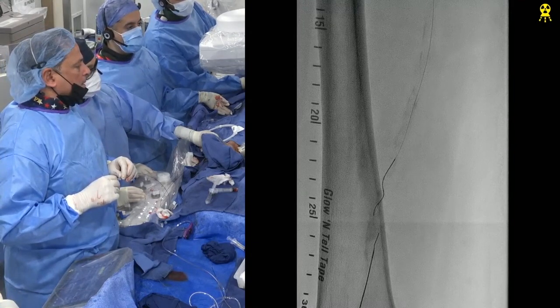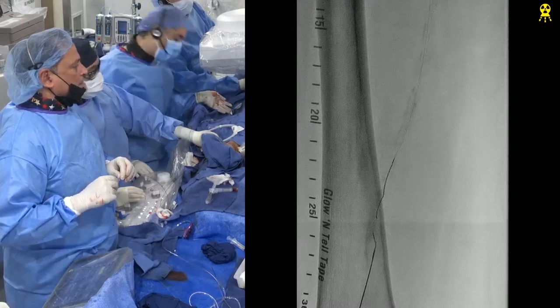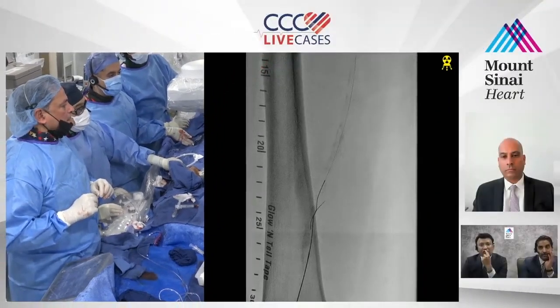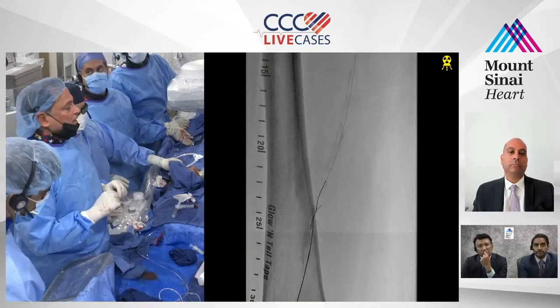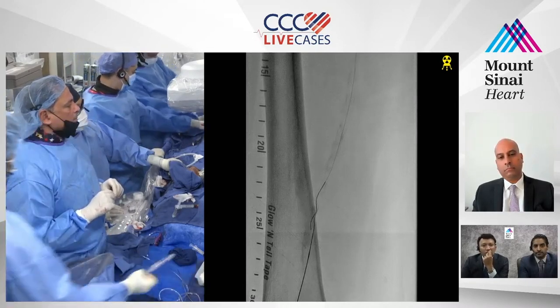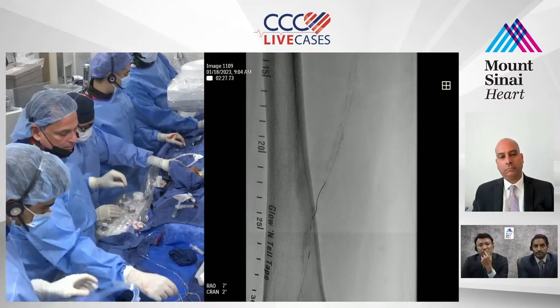You have a pedal access sheath? Yeah, we have a 4-5 slender. Actually, a 5-6 slender. Pedal access is fully sheathed. For the antegrade, no, we just have the micropuncture sheath. That's what I was talking about. We can take an 018 stiffer support wire if he doesn't want to put a sheath in. We can just bareback the 018. Correct. So give me a stiffer wire. Let's take a stiffer wire first, then exchange for an 018.